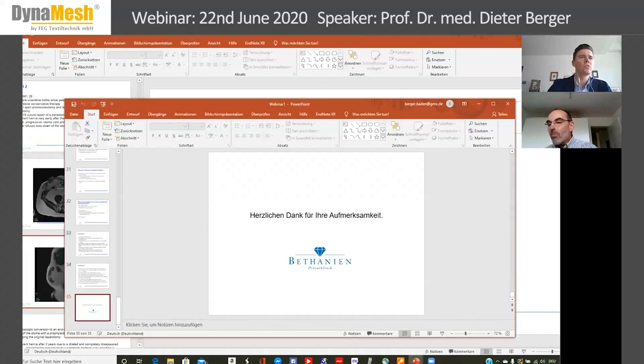Sorry, there's a clarification from Mr. Lopez. No, I mean he is using one mesh as keyhole plus a second mesh for covering the colon. So I think the question is, are you concerned about the extra material when you use the sandwich technique as opposed to a single mesh use in a Sugarbaker or the 3D funnel? I'm sorry. Okay. No, I'm not concerned about the amount of foreign material in the abdominal cavity, not at all. We have done it in these cases, and we have not seen any mesh-related complications.